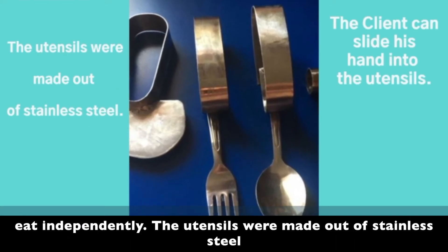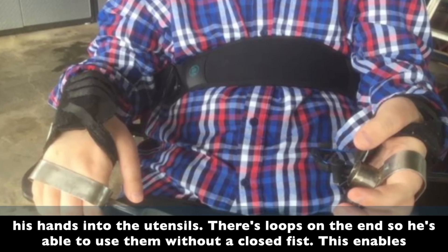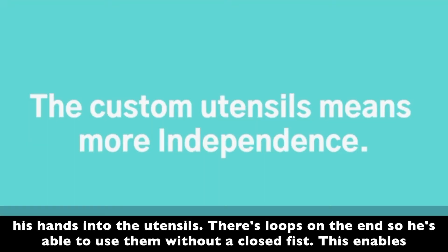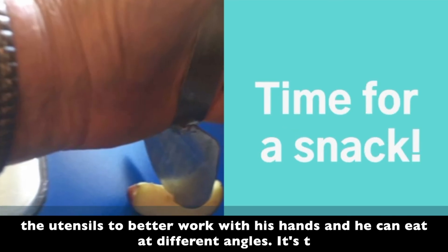The utensils were made out of stainless steel and they were designed so that the client can slide his hand into the utensils. There are loops on the end so he's able to use them without a closed fist. This enables the utensils to better work with his hand and he can eat at different angles.